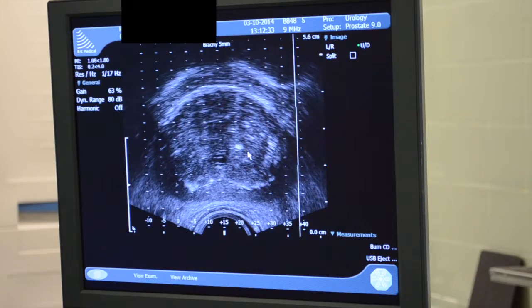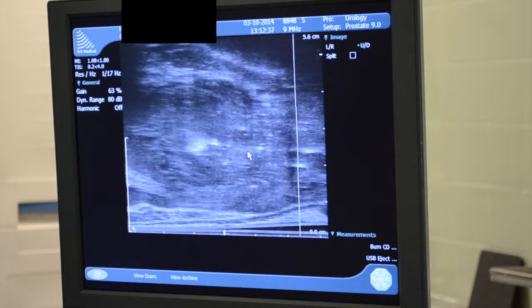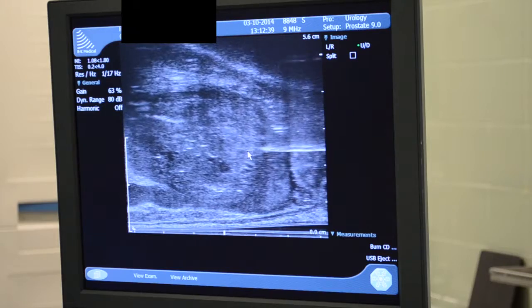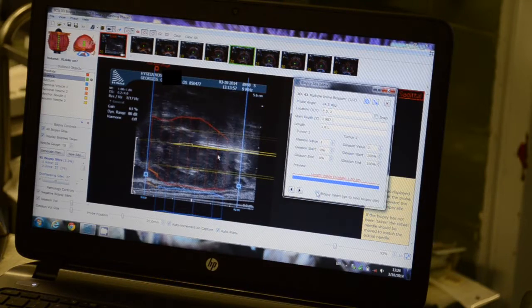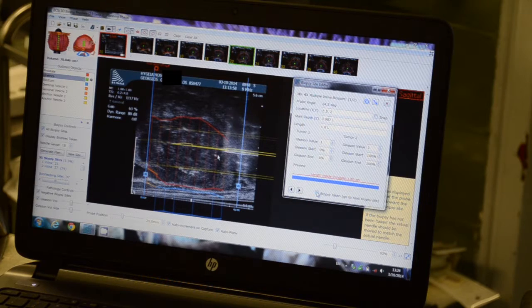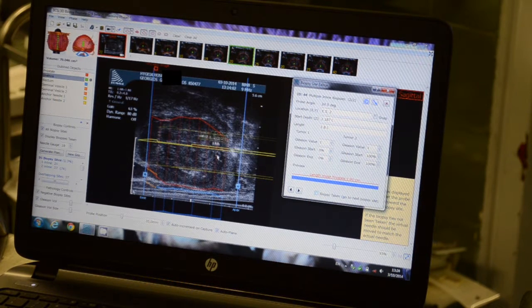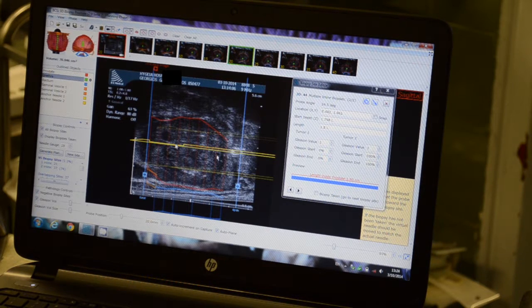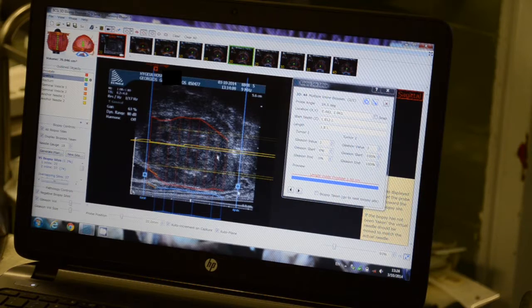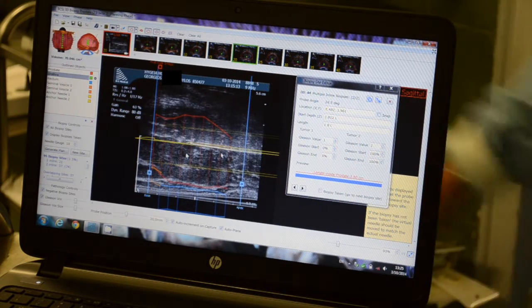Each sample is put into an individual vial. Here's an axial image of the prostate showing the next biopsy site. Imaging is switched to sagittal, the needle is brought back to the apex and fired. This next biopsy demonstrates two inline biopsies: first a biopsy is taken at the apex, then the needle is advanced to the mid portion of the prostate and a biopsy is taken from the mid portion all the way to the base. This allows the pathologist to reconstruct the core as one.